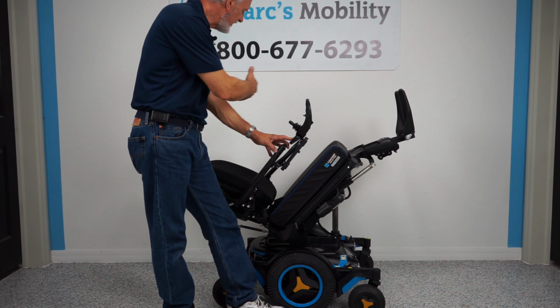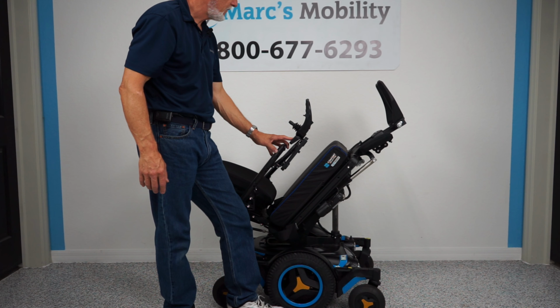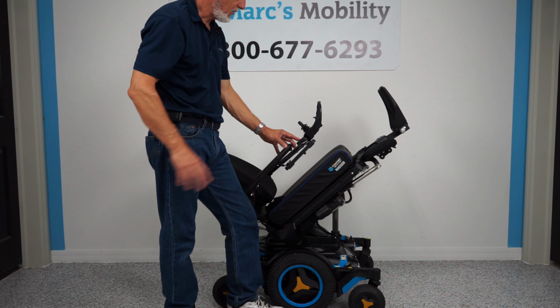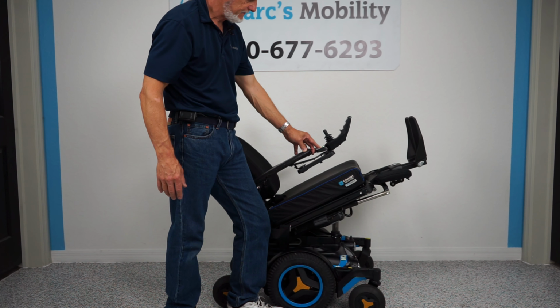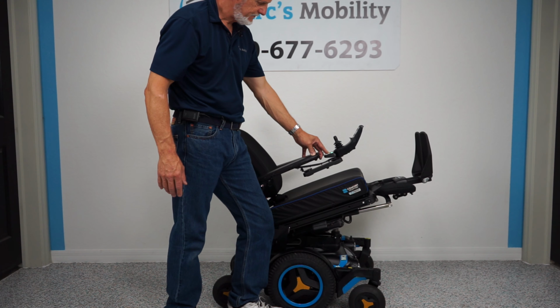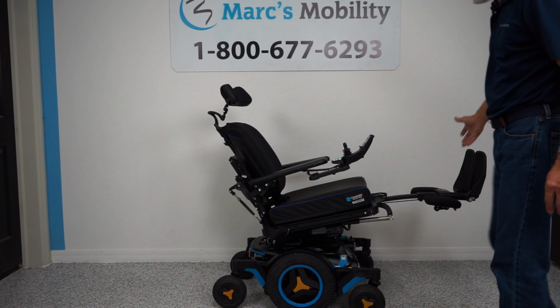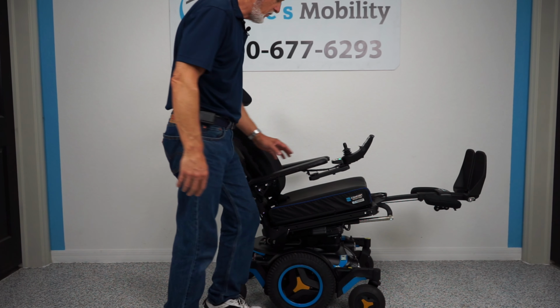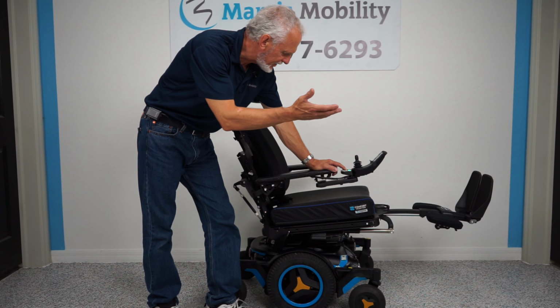So if you needed some circulation, this would be a little extreme. So you wouldn't have to be that far up. You can have the seat. I'm going to bring the seat down so you can see. You could be halfway tilted here and still have your feet above your body. Okay? So we've covered so far the tilt and the electric feet.